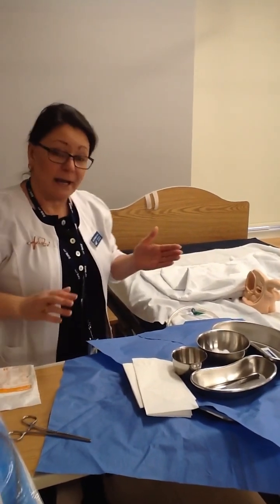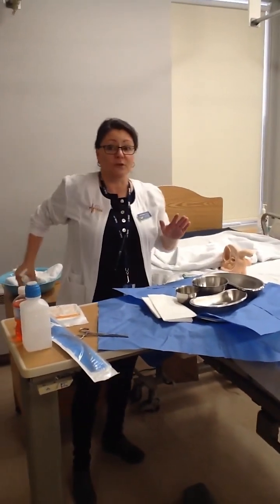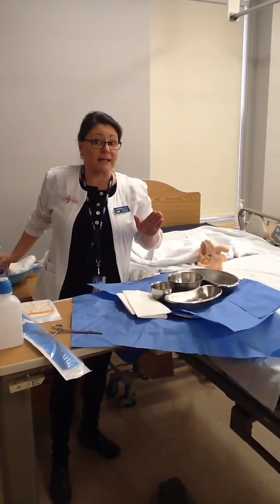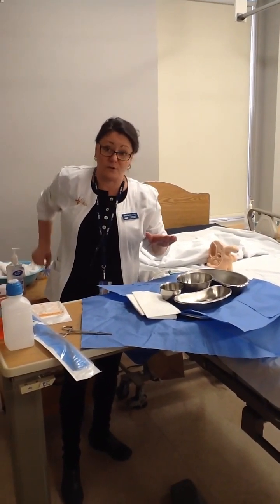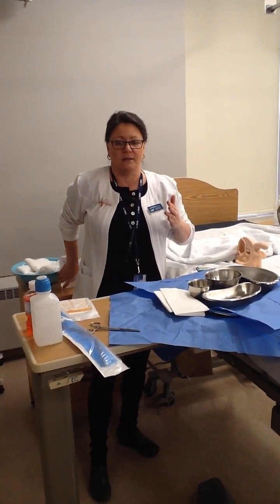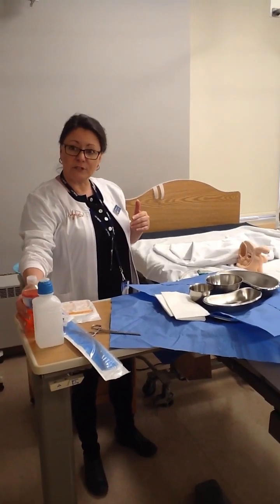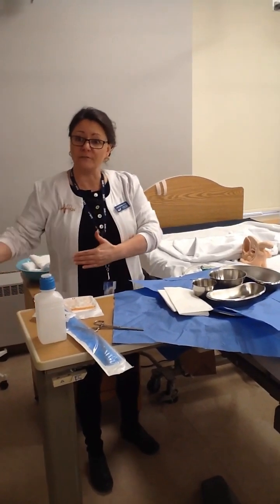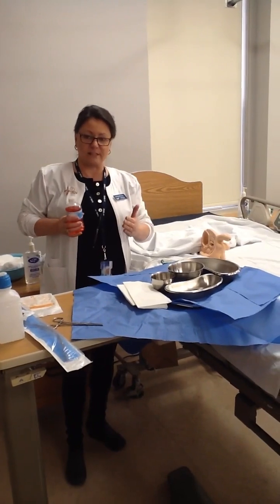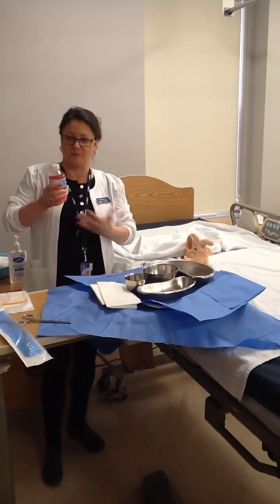So now I'm going to add my items. And I'm going to start by adding my cleansing solution first. I can move this hand sanitizer behind me. I don't need it anymore. And remember, I cannot take my eyes off of my sterile field, so I'm not turning my head, I'm just moving these items behind me. So I'm going to add my cleansing solution next. I'm going to reach for it, and I'm going to reach away from my tray so that I'm never ever risking dropping or exposing my tray to anything that could fall into it.